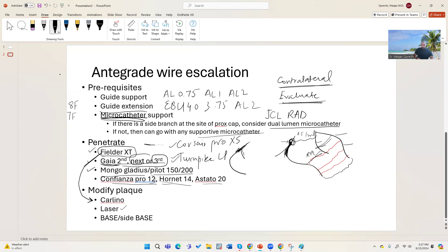You can also use laser — just hold it at the proximal cap for a few seconds, two or three runs — and it may soften the cap as well, allowing you to insert the wire afterwards. I've used that approach rarely.